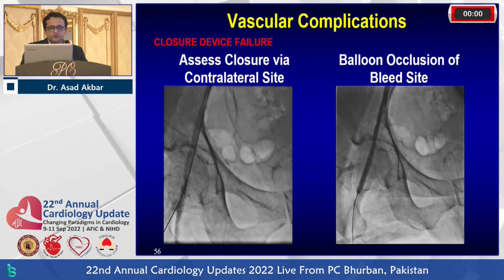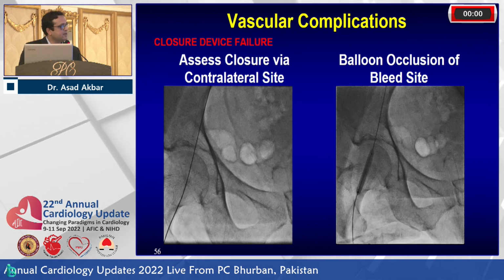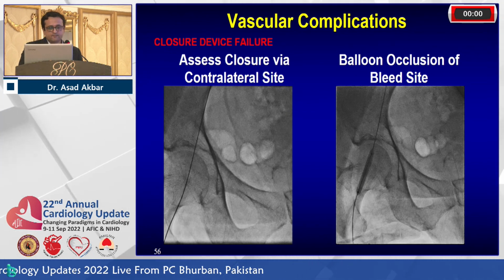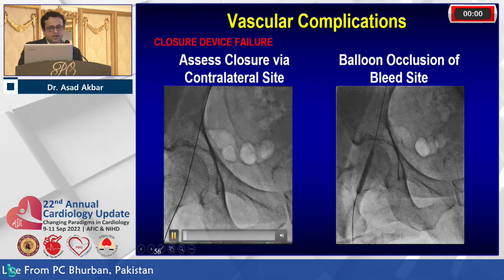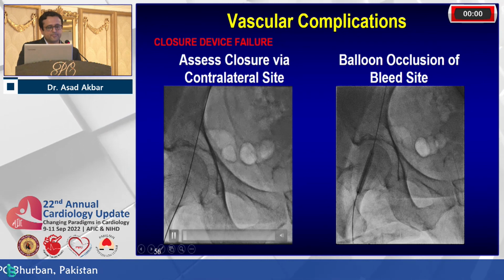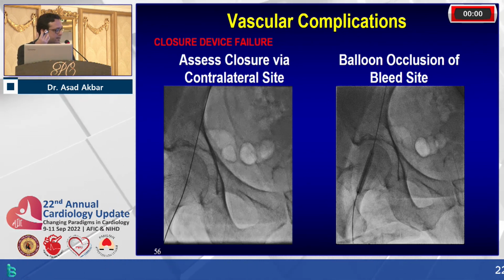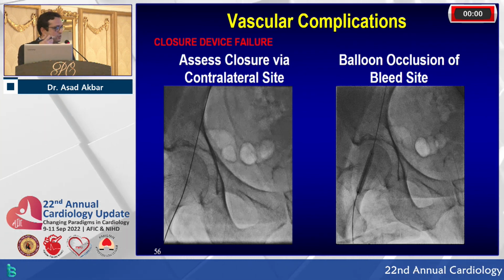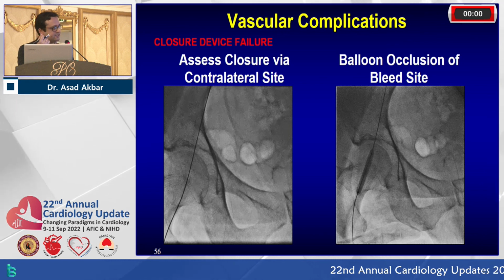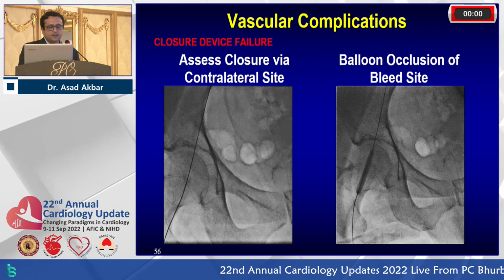And then in terms of vascular closure, I think the safest and easiest thing to do is, if you have a safety wire and there is bleeding around your access site after you've done your Perclose sutures, then you can put in a 6 or 7 balloon, depending on what the size was on the CT. Go up to minimal inflation pressure. Don't go up really high, because then you can cause a dissection. And then on top of it, you manually press and give some protamine and usually get away with it.